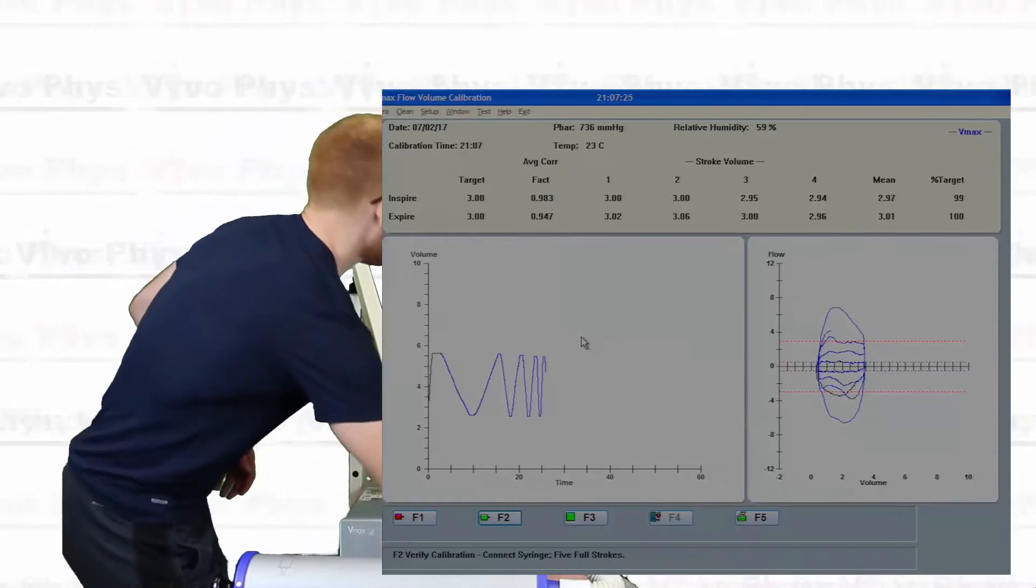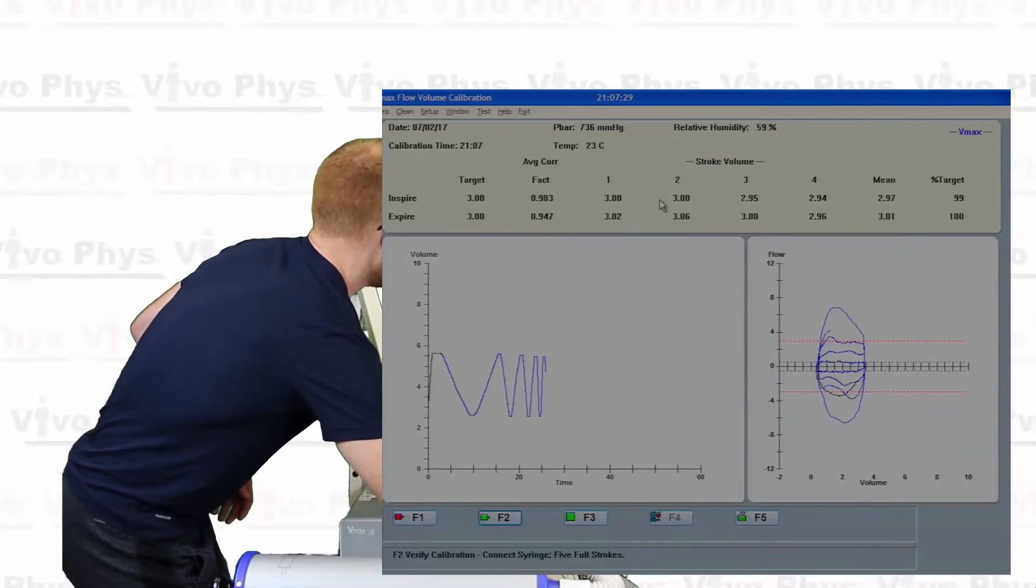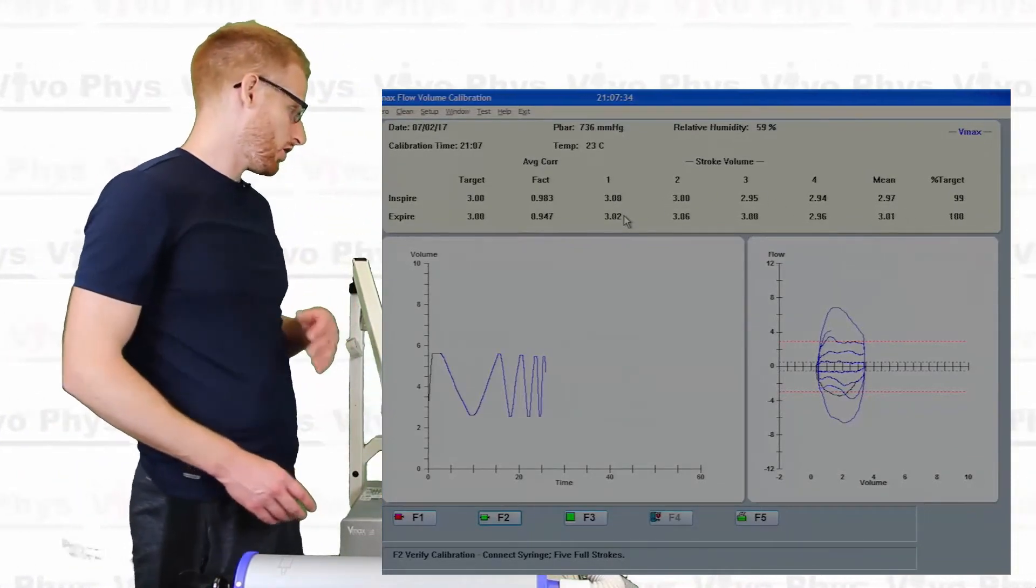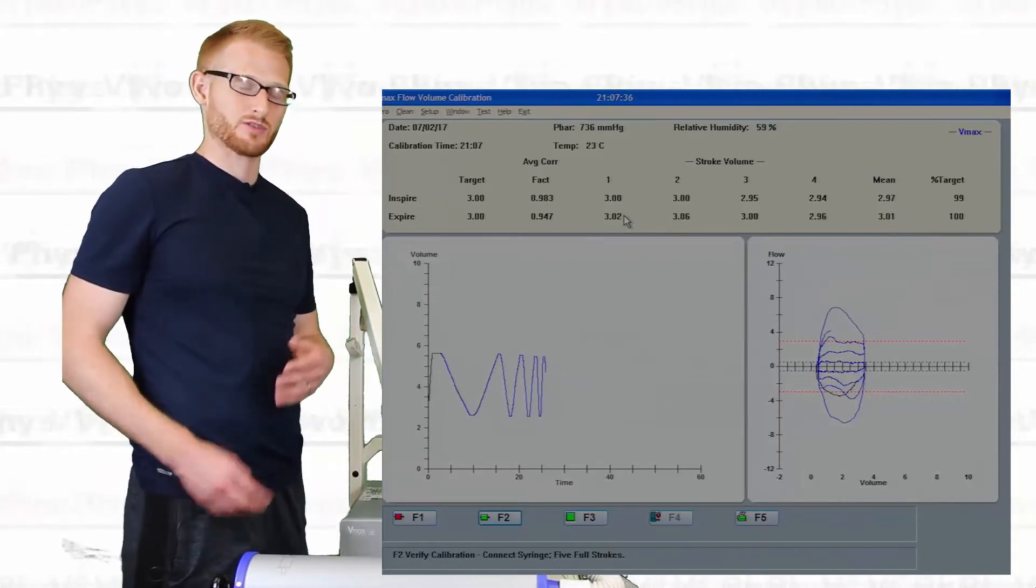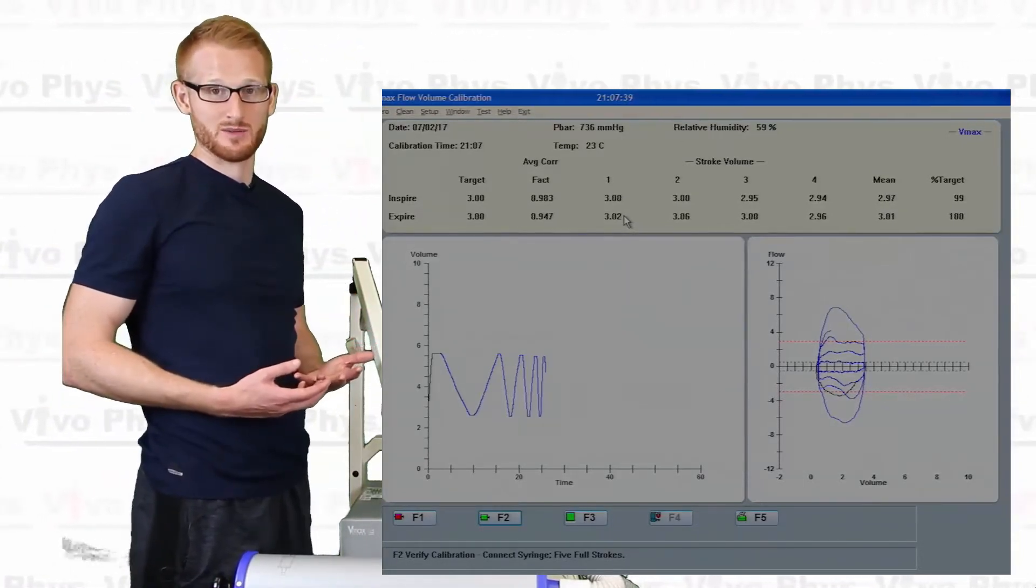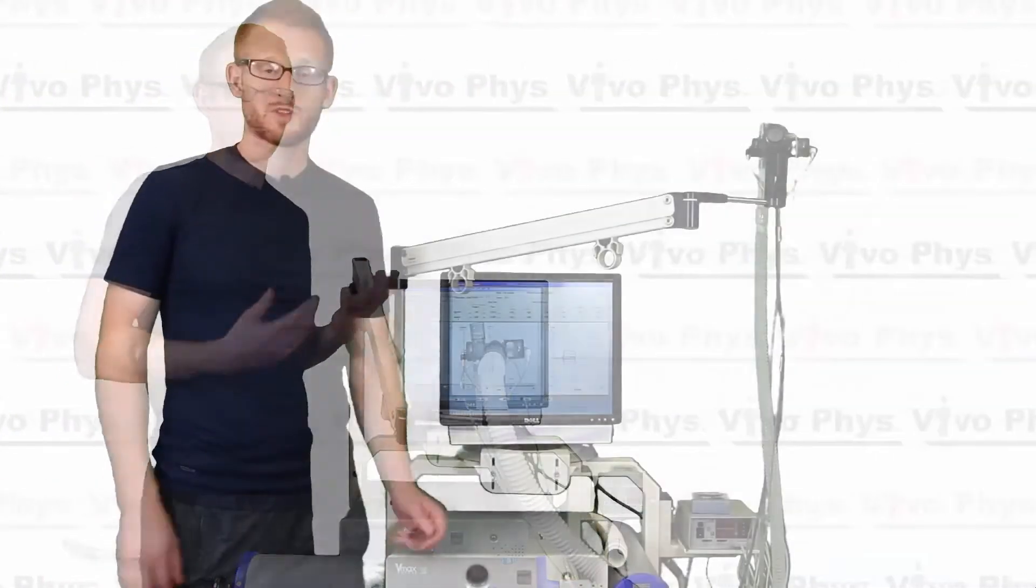However, you can always look here and see the difference between the inspired and expired error in these different trials. So the different strokes that we did. And they should all be pretty close to three. If they're not really close to three, it will give that error that we kept seeing there. So I had to do it three or four times at least there just to get it to work.